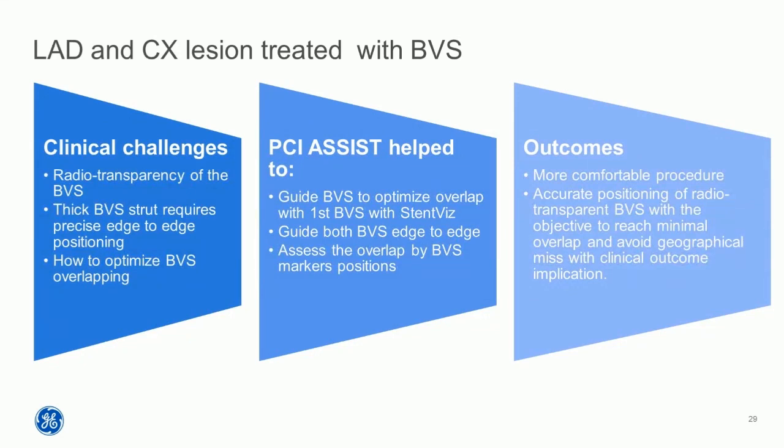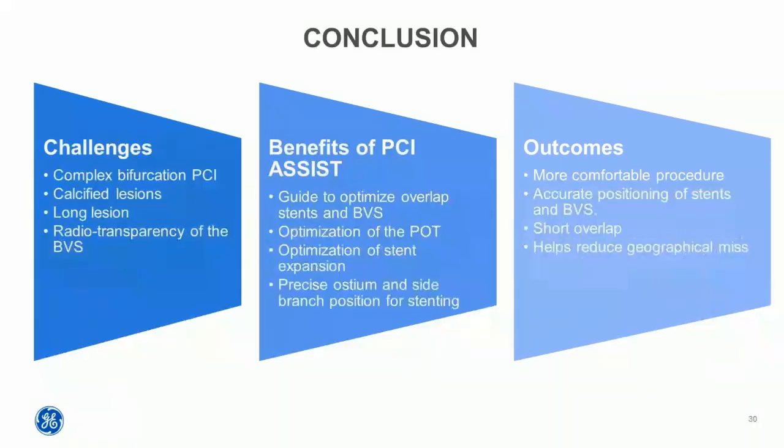So it is clear that this PCI assist is useful, very helpful for the use of BVS, which are very radio-transparent. So in our daily practice, we need some tools to optimize the visualization of these kind of devices to optimize the PCIs for very young patients.